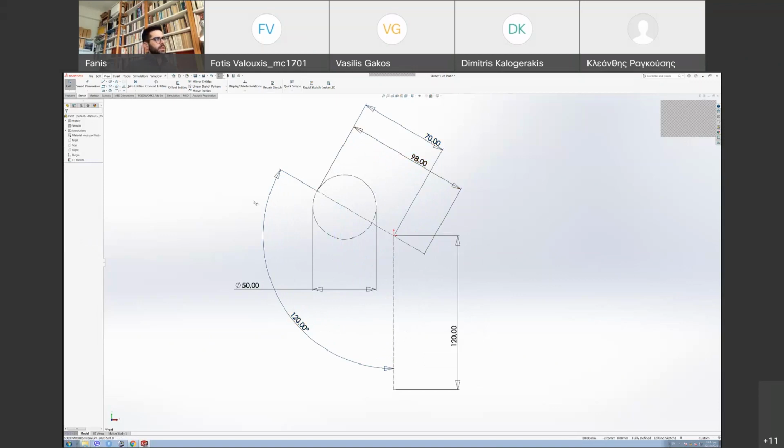The 3D model that I'm gonna create is not so much accurate, but there are several simplifications inside, so it's not really a big deal for you to design it. I think you can design it pretty easily. But if you have any problems, again, do say so, okay, guys? But I will provide you with a detailed 2D design, guys, okay? So we will just make a really rough outline now.